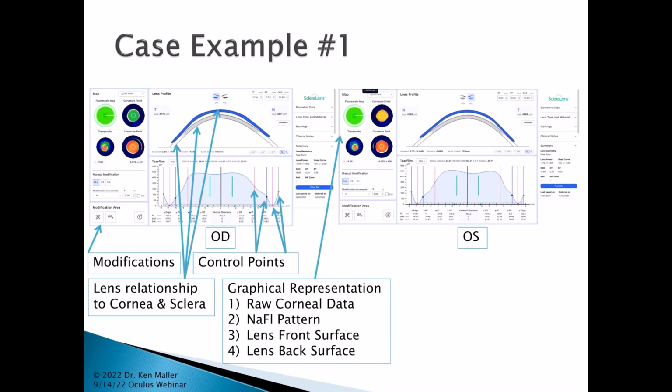And on this particular eye, on the lens, you can see in the center we have sort of an orange color surrounded by a red color, and then in the bottom half there's kind of a white arc, and then there's some blue, and there's a little bit of a green blip on the nasal side of that particular lens, and that's actually representing asymmetry that's contained within this lens.